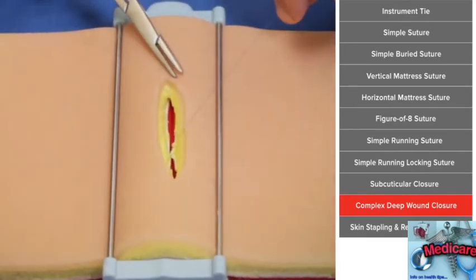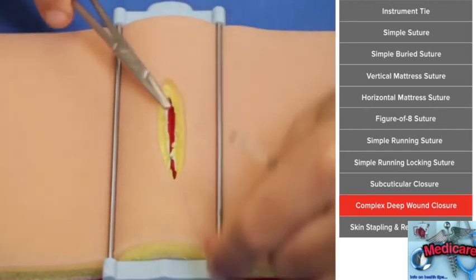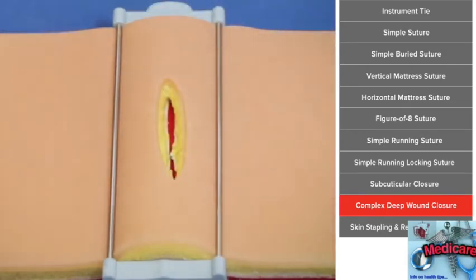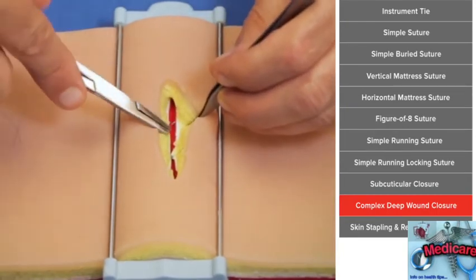And remember, you're pretty deep here, so you're going to want to not only lock the knot, but then once you're pulling things down, it's almost easier to pull it along the wound itself. Otherwise, the skin may prevent you from tying all the way down. So we're going to put a couple of interrupted simple stitches here to close the fascia.